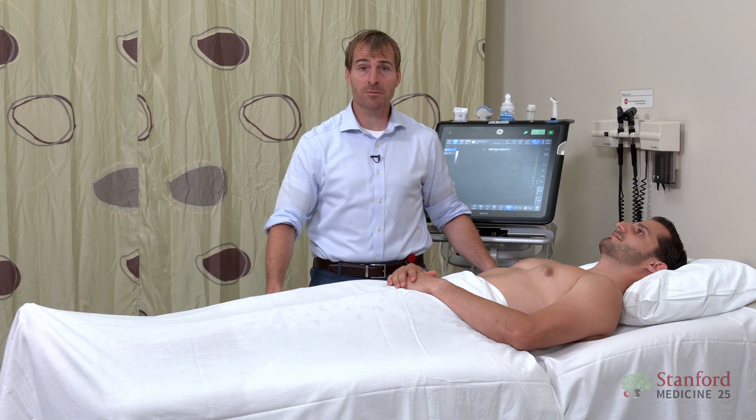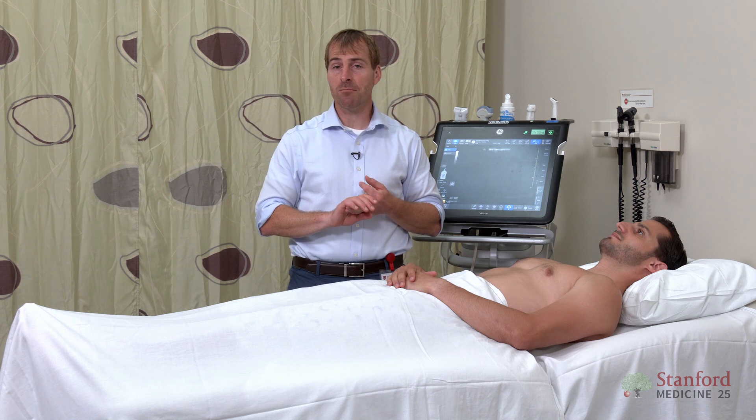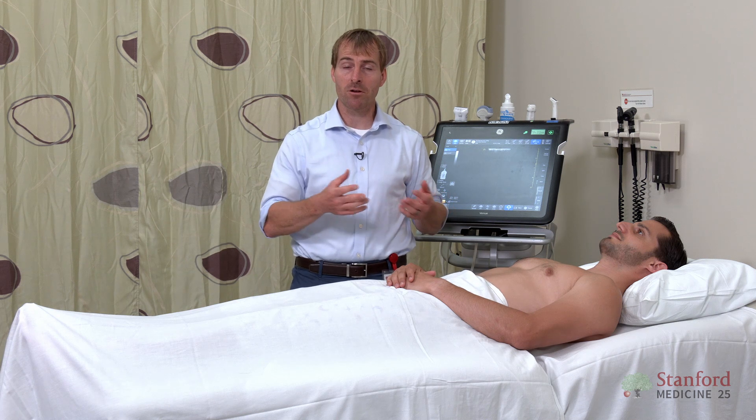Hi, I'm Dr. John Kugler with the Stanford 25 Ultrasound Series. Today we're going to be learning about lung ultrasound, which is really important, especially in my practice as a hospitalist. I use lung ultrasound all the time to evaluate patients for various conditions. Today I want to focus on pneumothorax, pleural effusions, as well as telling the difference between A-lines and B-lines, which will help us to better understand if a patient might have pulmonary edema or pneumonia.